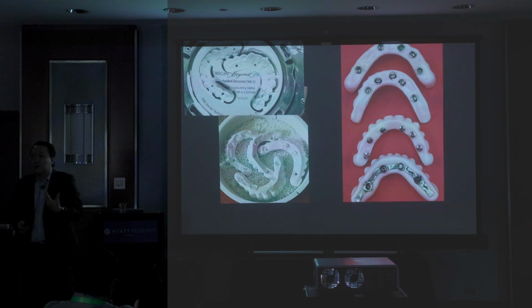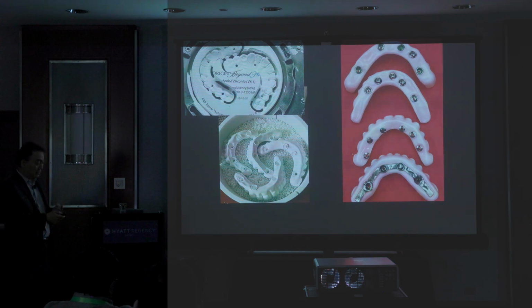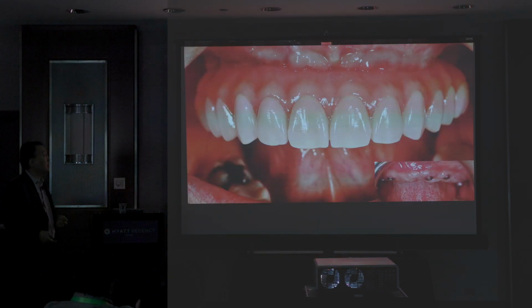We tested it without stabilizer, right? Everybody uses a stabilizer, right? It works, I would say 50%, 70%. When we have a good position of the implant, then good. But whenever I have a bad angulation, you have to put the stabilizer. That's what I would like to share when people have questions.